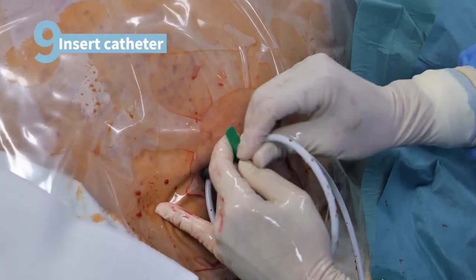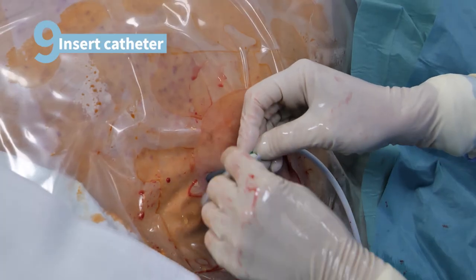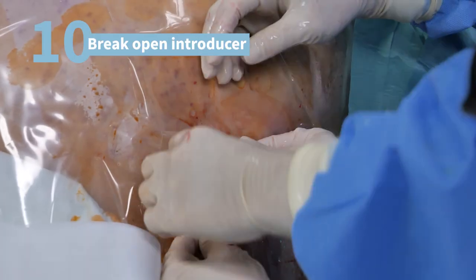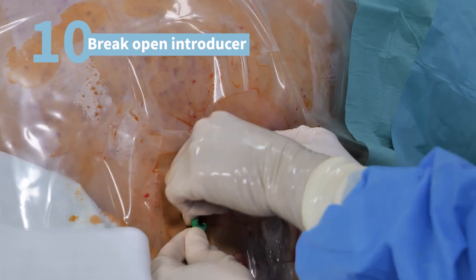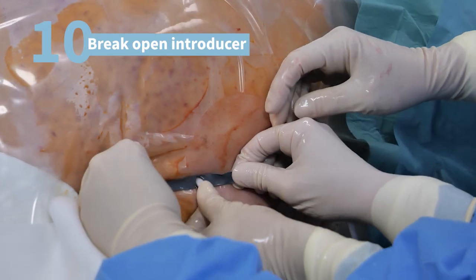And now the distal end of the catheter is inserted over the introducer, and the base of the introducer is broken apart, and the catheter is pushed in centimeter by centimeter. The introducer is increasingly opened and retracted until the entire catheter is completely inserted into the abdomen.